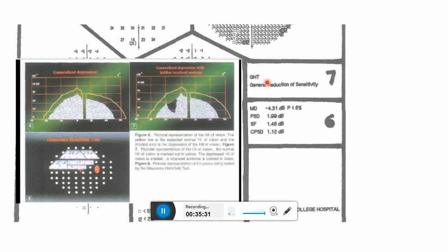Zone 7 consists of the glaucoma hemifield test (GHT). Glaucoma affects the retinal ganglion cells on either side of the horizontal meridian. Therefore, 5 areas with a set of retinal points in each area are tested on both sides of the horizontal meridian and compared. The results are displayed as GHT within normal limits, GHT borderline, or GHT outside normal limits.